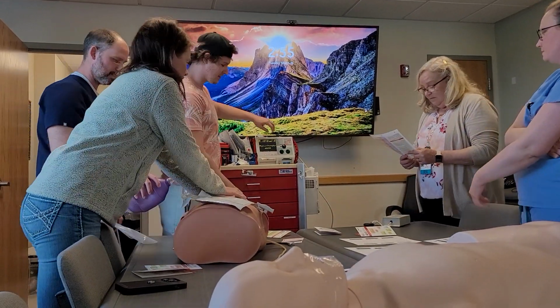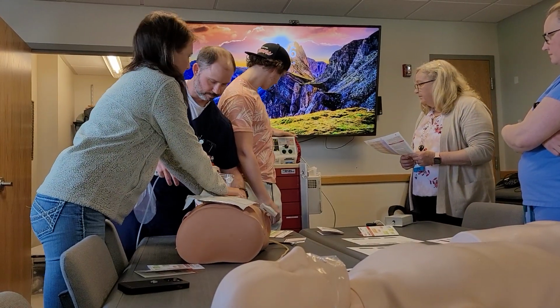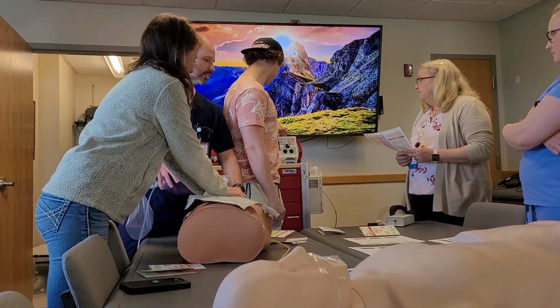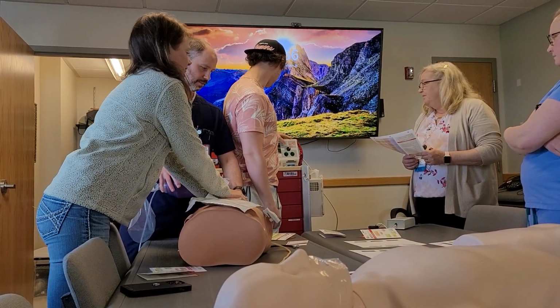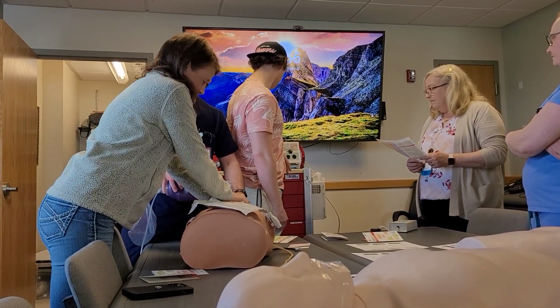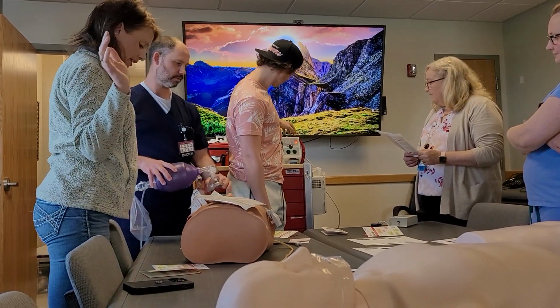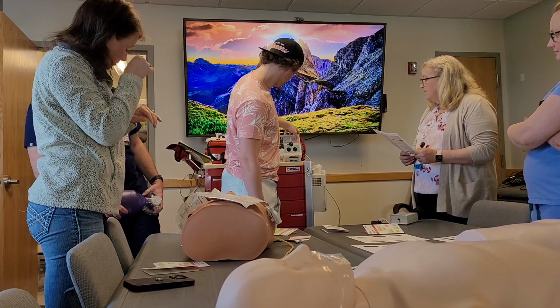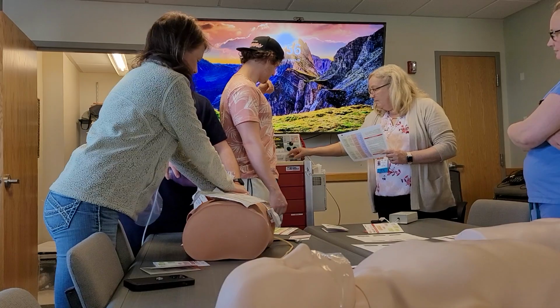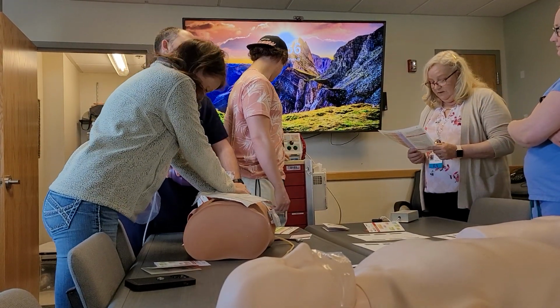I'm gonna get the defib on. Going to 200. Are you gonna try to sync this rhythm? I am not. It's just gonna be a big shock. Okay, make sure it's 200. 200 started. Okay. Charging. Clear patient. Clear. Shocking. Shock. Continue high quality CPR, please. Okay, so how long are we gonna do CPR for? 2 minutes. 2 minutes, and then what are we gonna do?